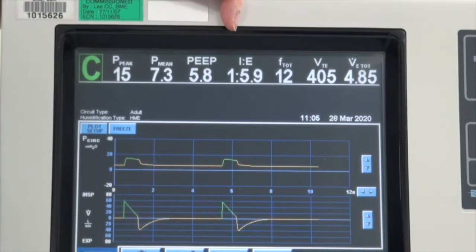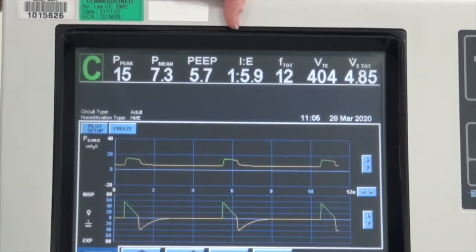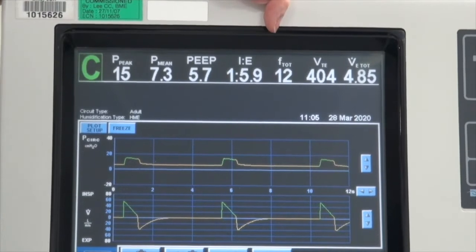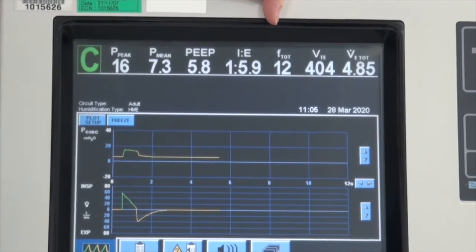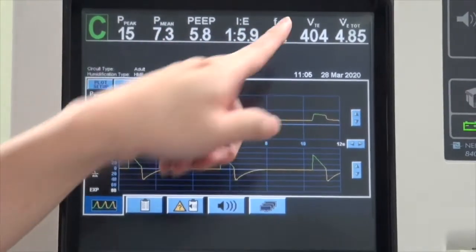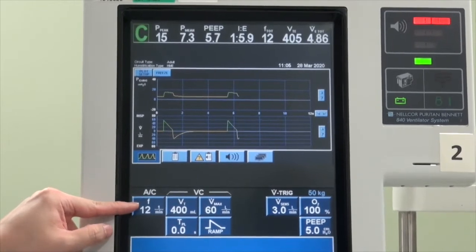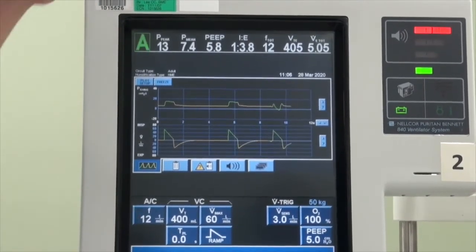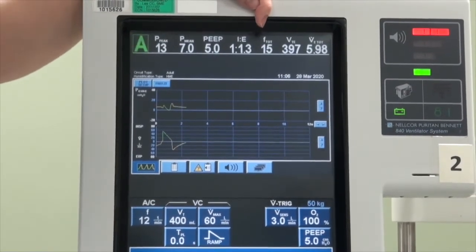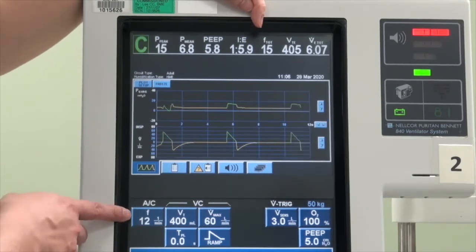The next reading is the inspiratory-to-expiratory ratio. As shown earlier, by manipulating the respiratory rate, volume, and flow, you can change the ratio of the inspiration-to-expiration cycle, and this is continuously monitored and reflected above. The next reading is the measured frequency. In patients who are completely paralyzed, the trigger is entirely by the ventilator and these numbers will be exactly the same as what you have set. But in patients who have the ability to trigger, every breath is assisted by the ventilator, and this reading can potentially go much higher than what you set.